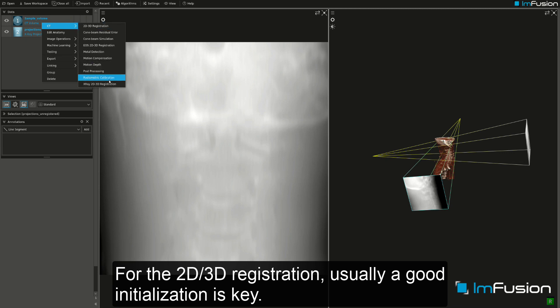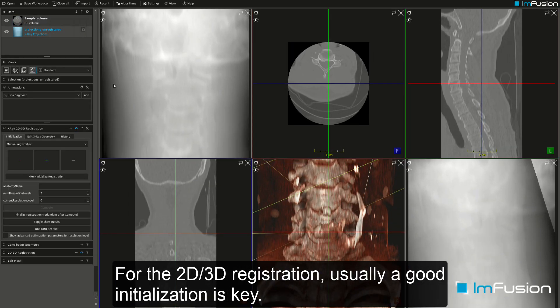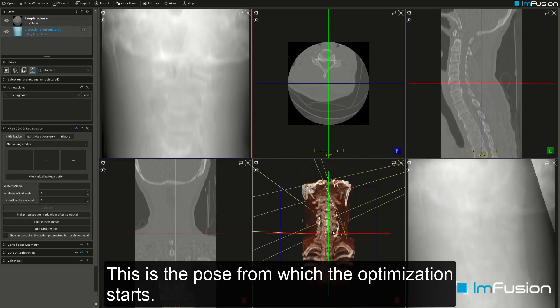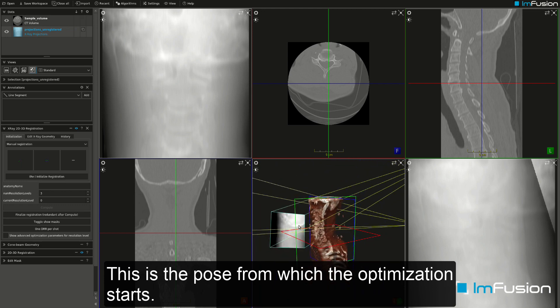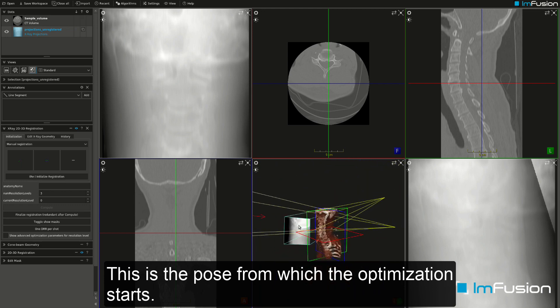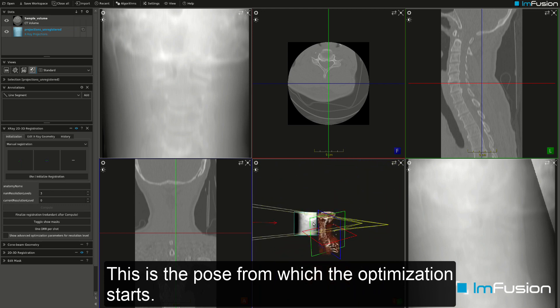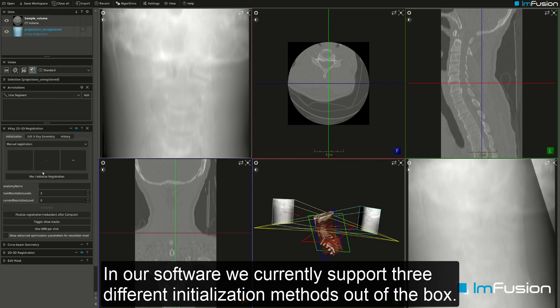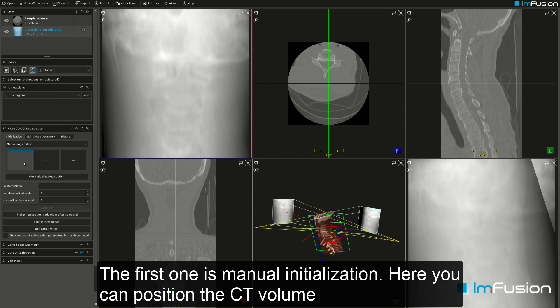For 2D-3D registration, a good initialization is key — this is the pose from which the optimization starts. Our software currently supports three different initialization methods out of the box. The first one is manual initialization.